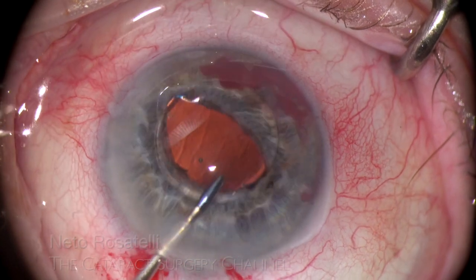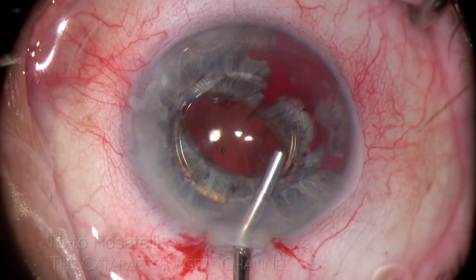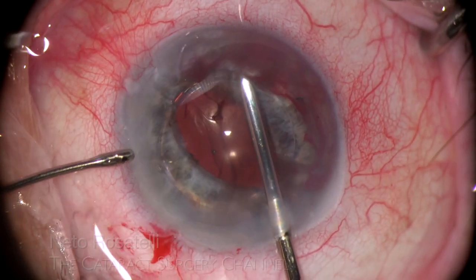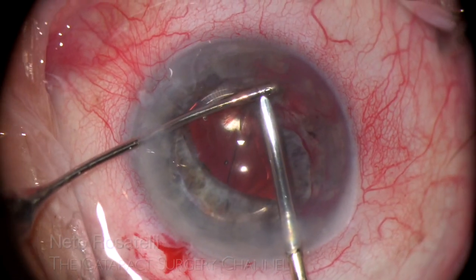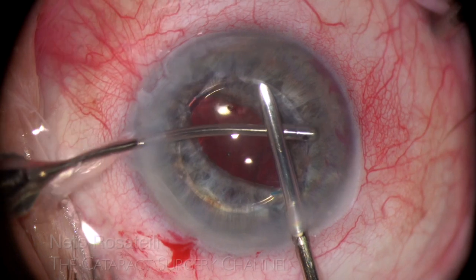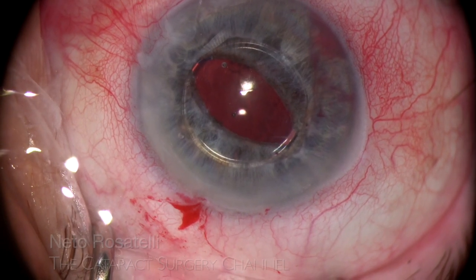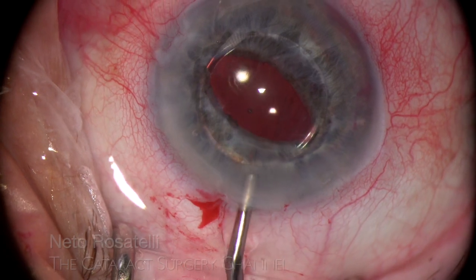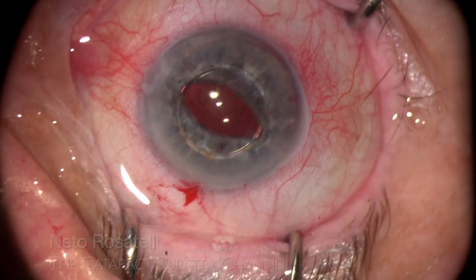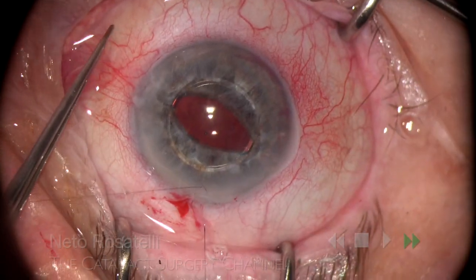I check sulcus positioning by gently forcing down the IOL and am rewarded that it does not move. I immediately pressurize the anterior chamber with OVD and proceed to wash and aspirate the bleeding before it coagulates and hampers visualization of the intended fixation site. Things are looking great. Despite being a 2.8mm incision and able to be sealed with hydration, it is much better to suture it, ensuring a stable anterior chamber during the fixation process. 10-0 nylon is used — a simple X-suture does it.